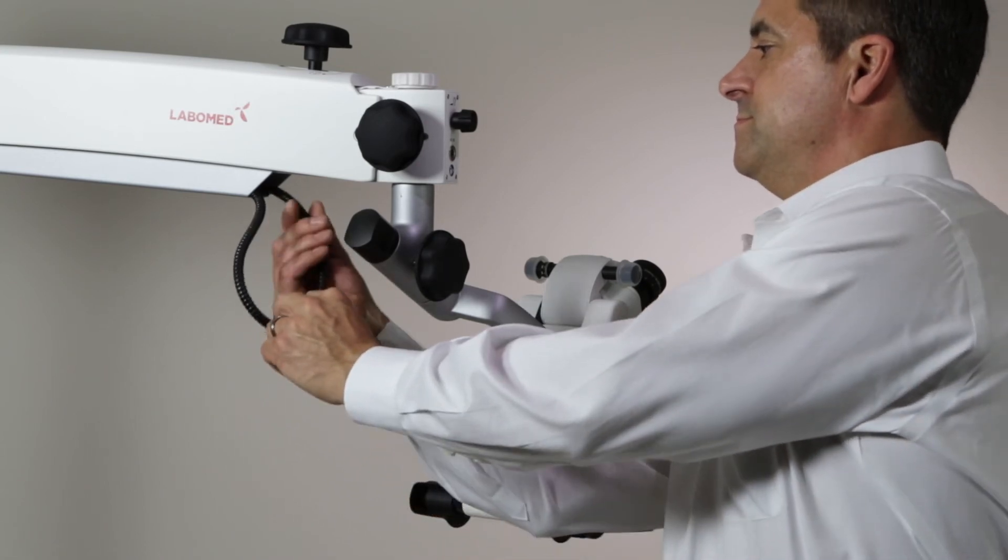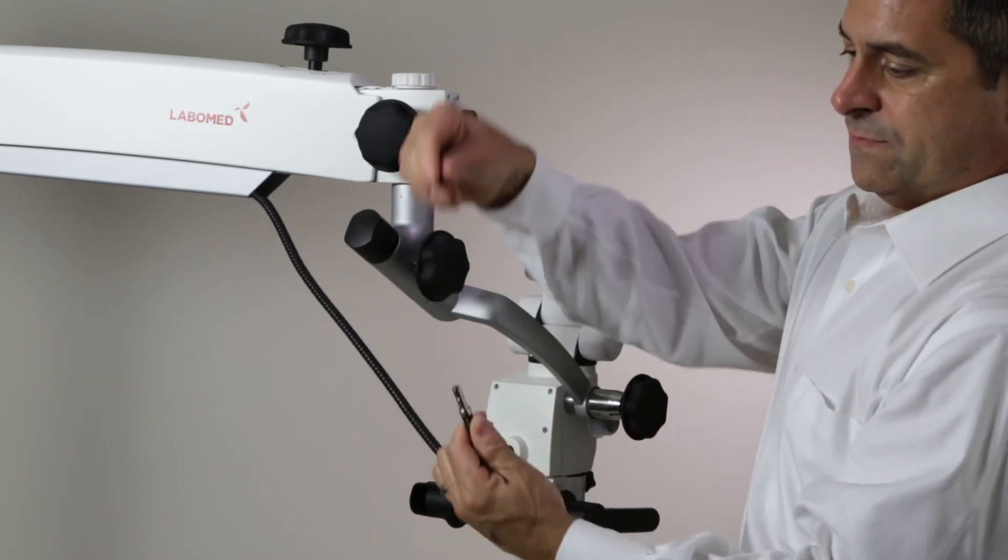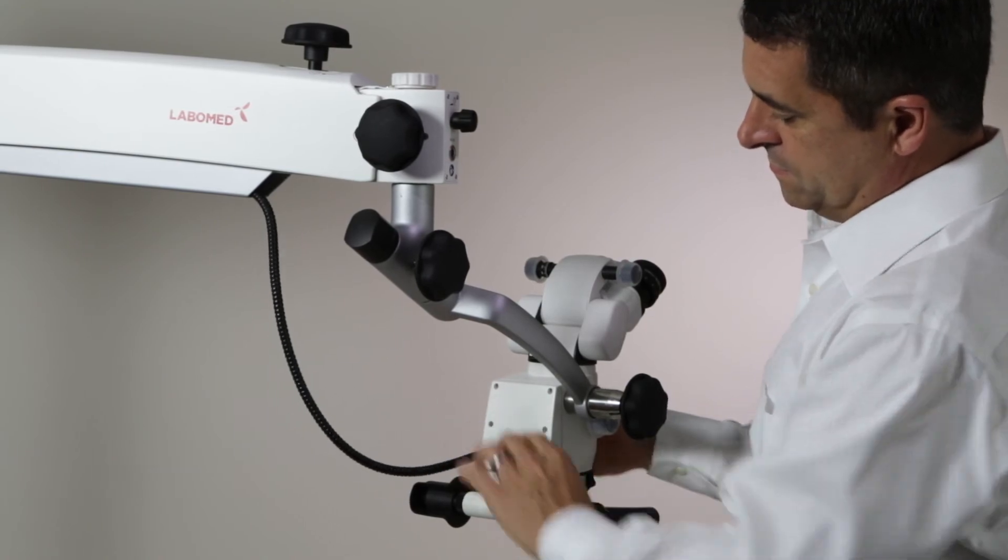Remove the nylon tip from the fiber optic cable and attach the cable to the slot provided on the back of the microscope.